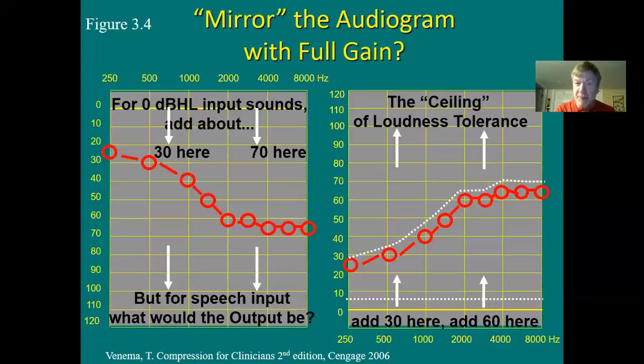That's another story. Look at the right side audiogram. You'll see the guy's hearing loss plotted up now. And if you look at, let's say, soft sounds like 5 decibels, look at the bottom dotted line. For the guy to hear all those 5 decibel inputs, we'd have to amplify them by the full degree of the hearing loss, wouldn't we?